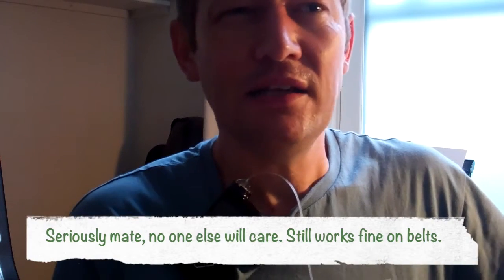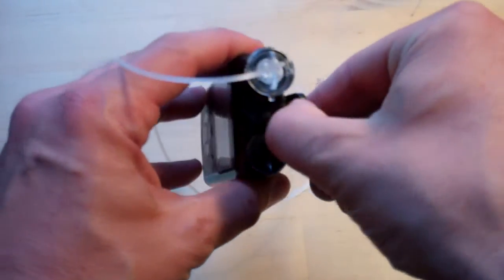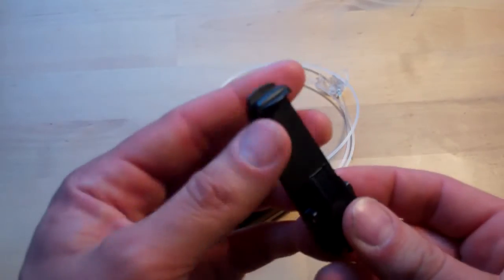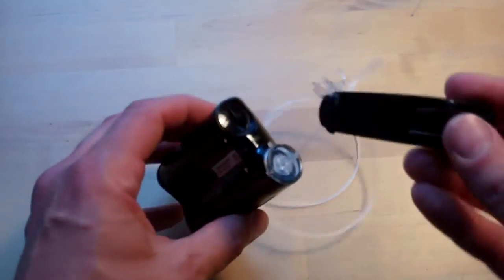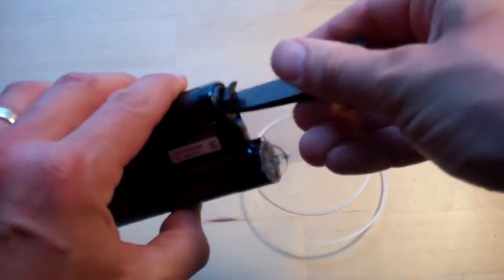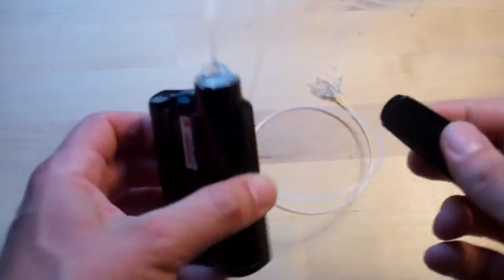So what I have to do now is clip it up higher — it's not the end of the world, but it's just a little niggly thing where you think, 'I wish they hadn't done that.' They've got a nice little trick though: if you take the belt clip off, the end becomes a tool for the battery cap, so you don't have to worry about keeping a penny in your pocket.